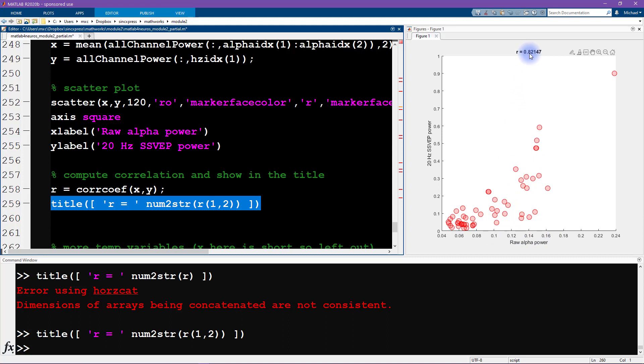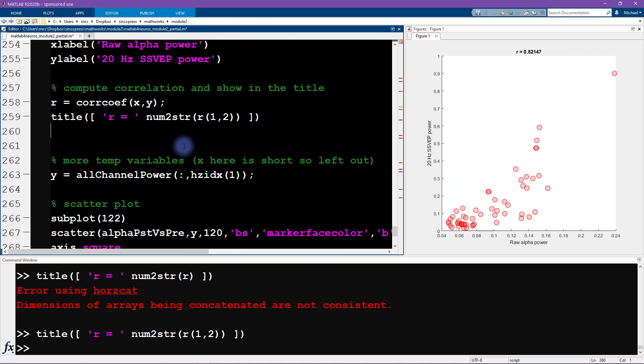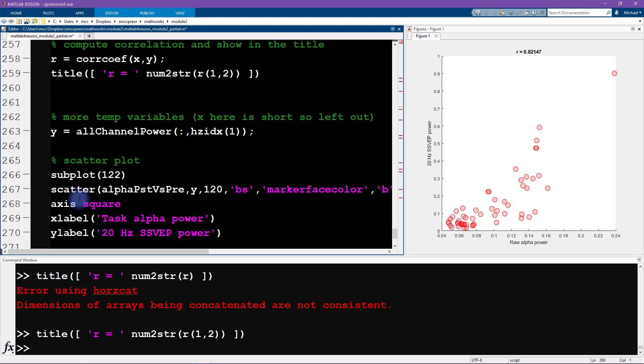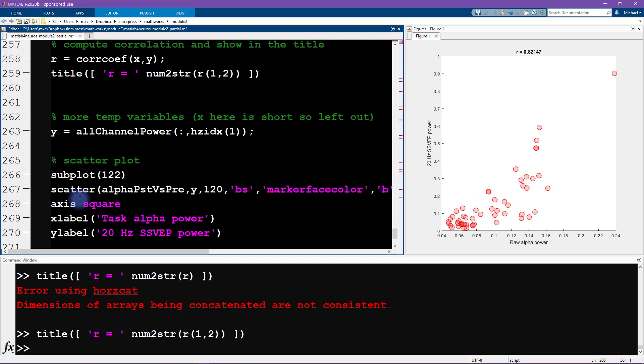Very nice, so this is one of the two scatter plots and we see that raw alpha power is strongly correlated, 0.82 strongly correlated with the 20 hertz SSVEP power. So that's pretty interesting; these are totally different frequencies, this one is endogenous, this one is stimulus driven, and they're pretty strongly correlated with each other.